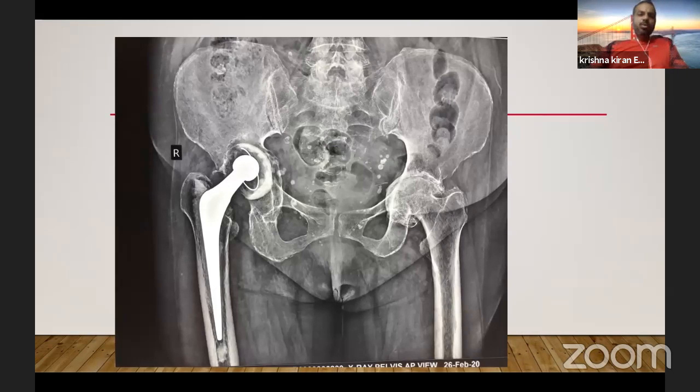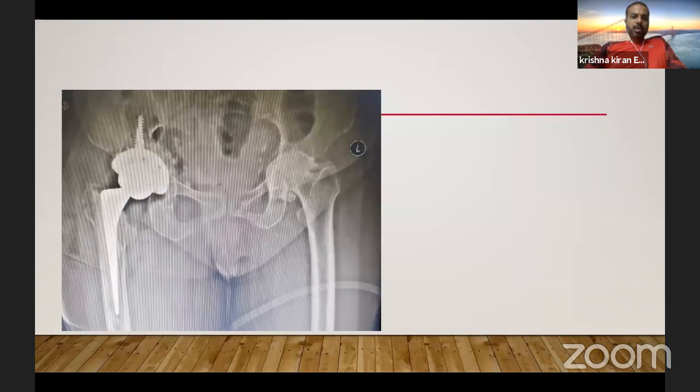So before we go to the formal femoral revision, there is a subcategory where the cement mantle looks reasonably good. So this is an aseptic loosening on the acetabular side with a reasonably well cemented collarless polished tapered stem. So you can see that the cement bone interface is largely intact and there is adequate cement mantle. So you don't need to remove this entire cement and do a big revision in this 80-year-old patient. So what we did was what we call a cement in cement revision.